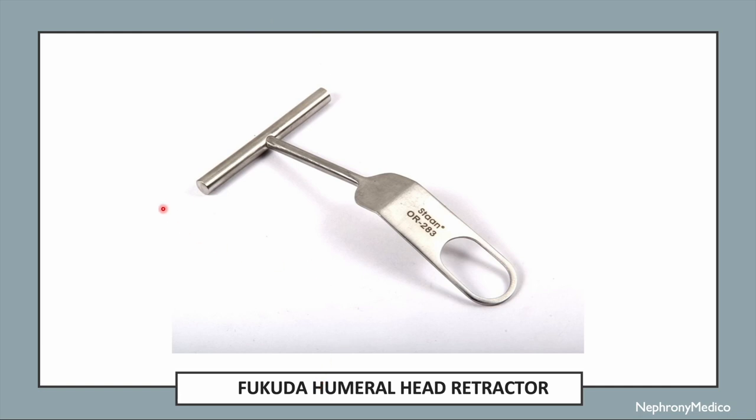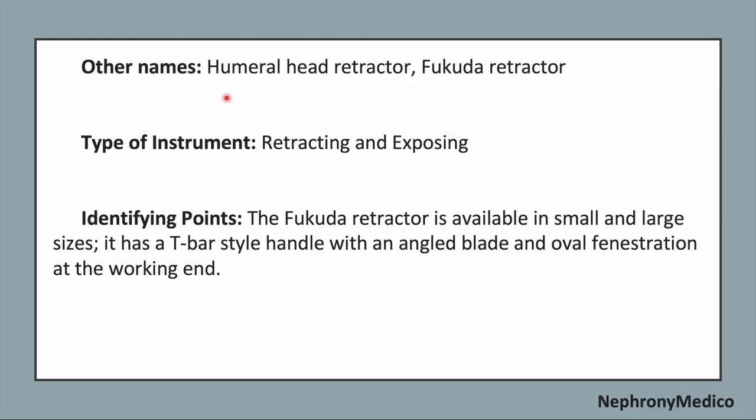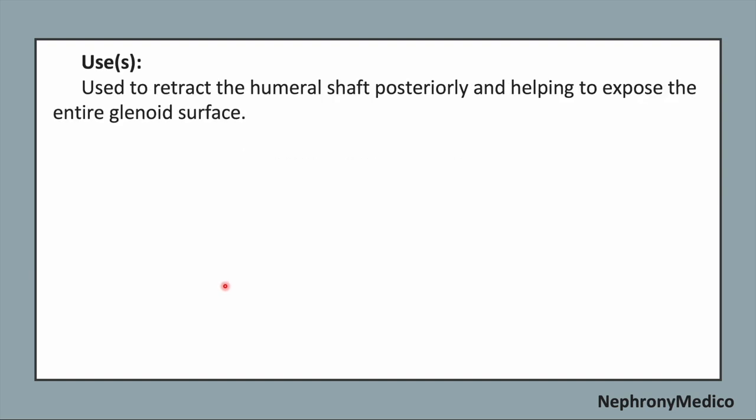Let's talk about Fukuda humeral head retractor. This is a picture showing Fukuda humeral head retractor. The other name is humeral head retractor or Fukuda retractor only. It is a retracting and exposing type of instrument. Identifying points. The Fukuda retractor is available in small and large size, and it has a T-bar style handle with an angled blade and oval fenestration at the working end. Use.